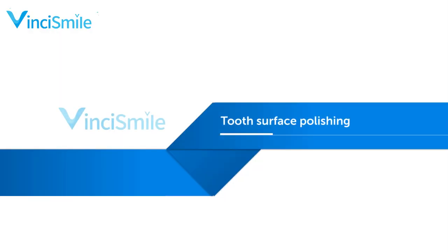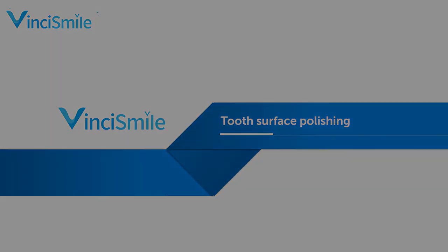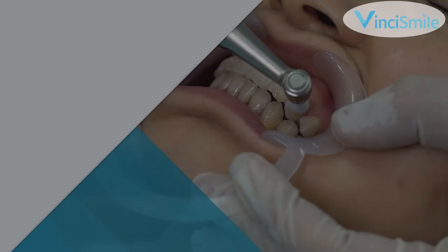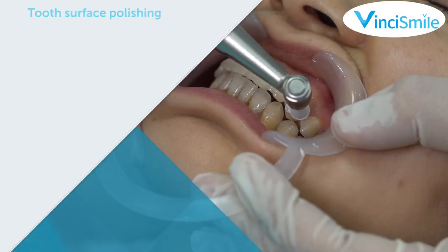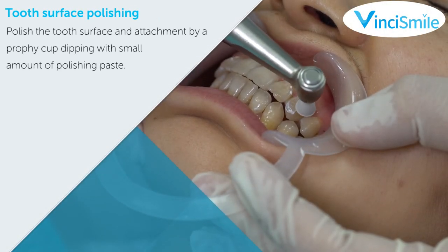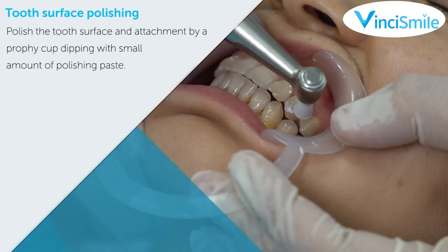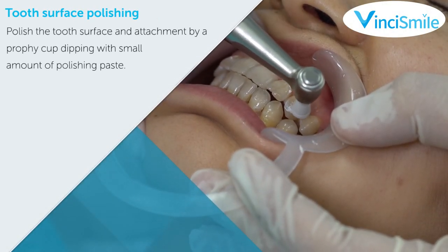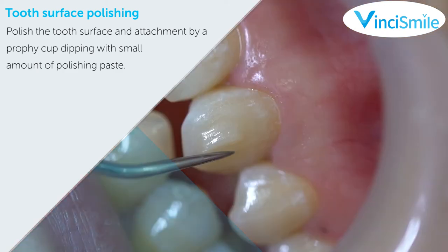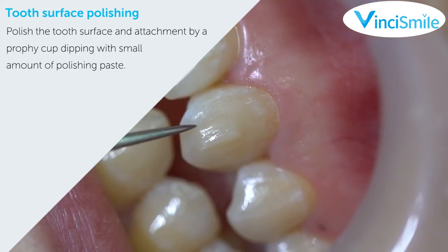Tooth surface polishing: polish the tooth surface and attachment using a prophy cup dipped with a small amount of polishing paste. The attachment is now bonded.